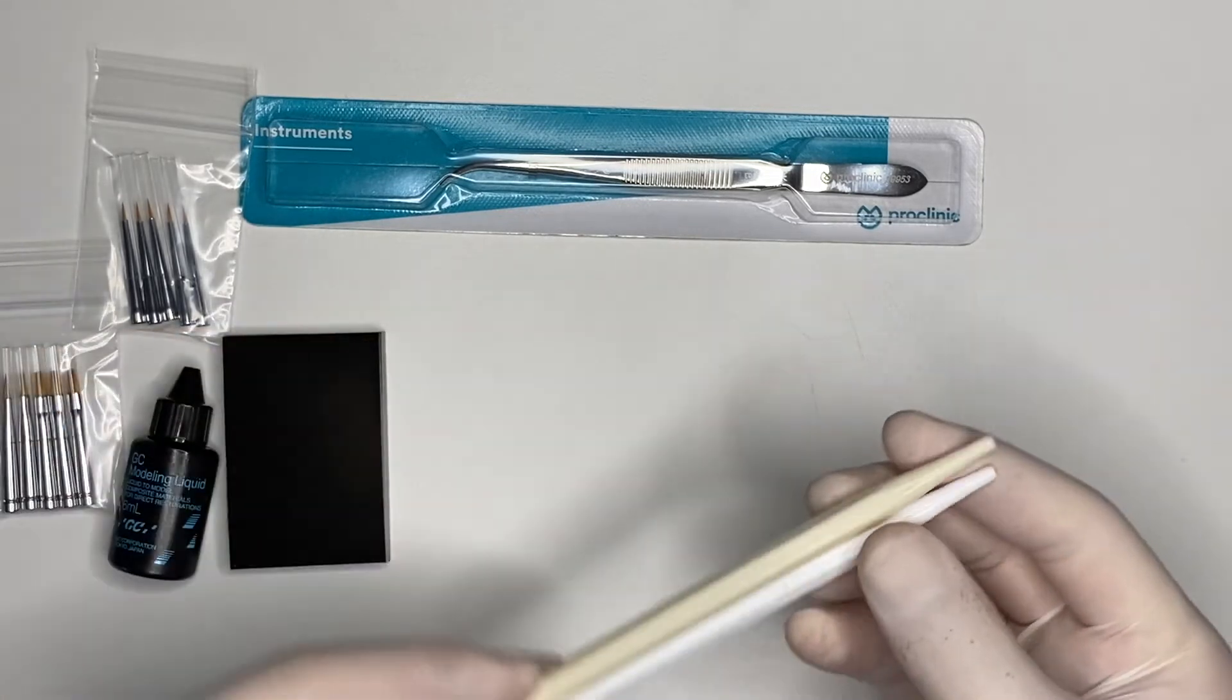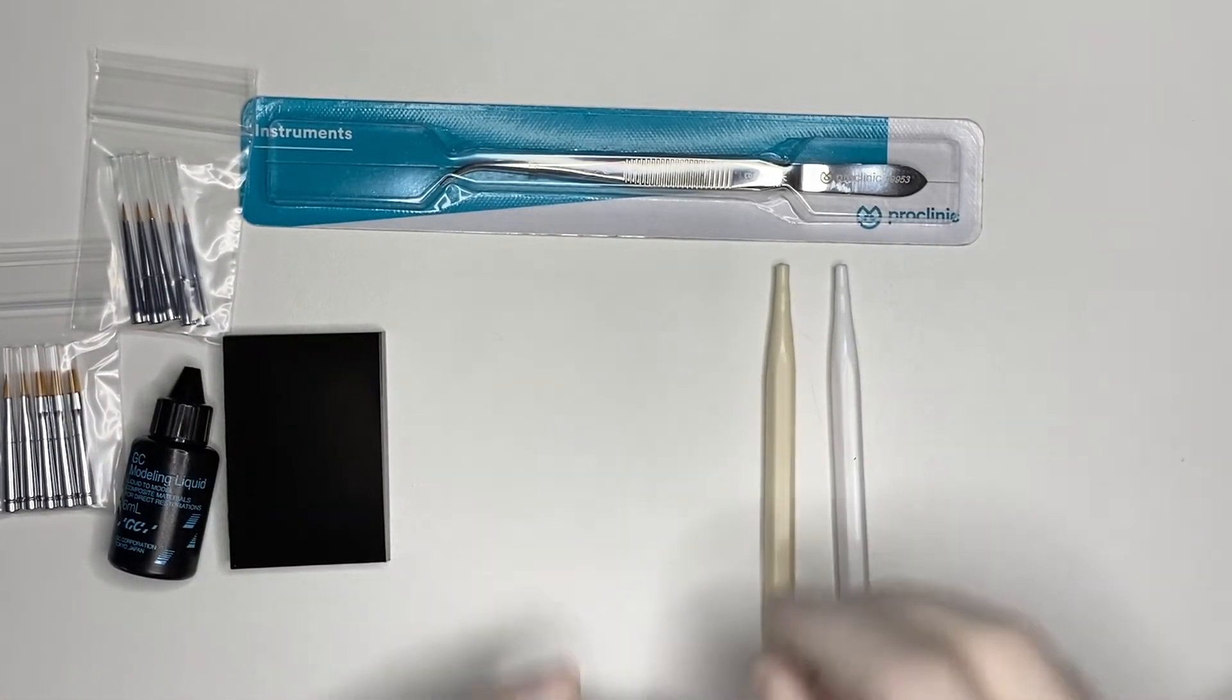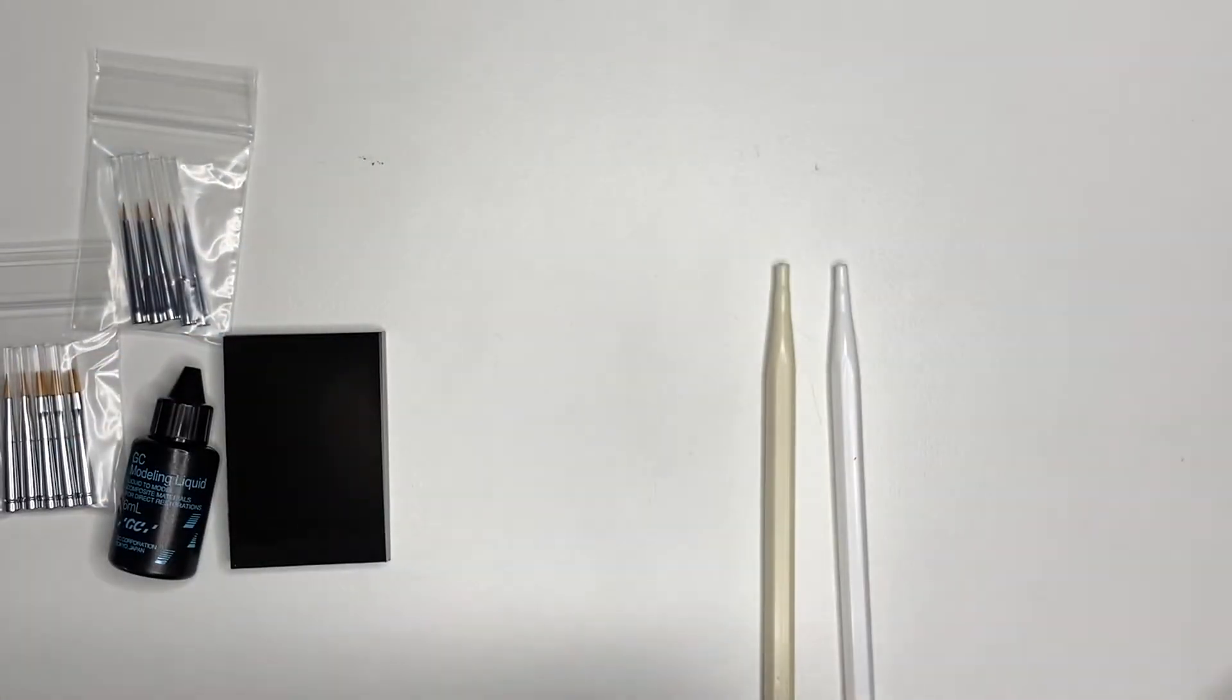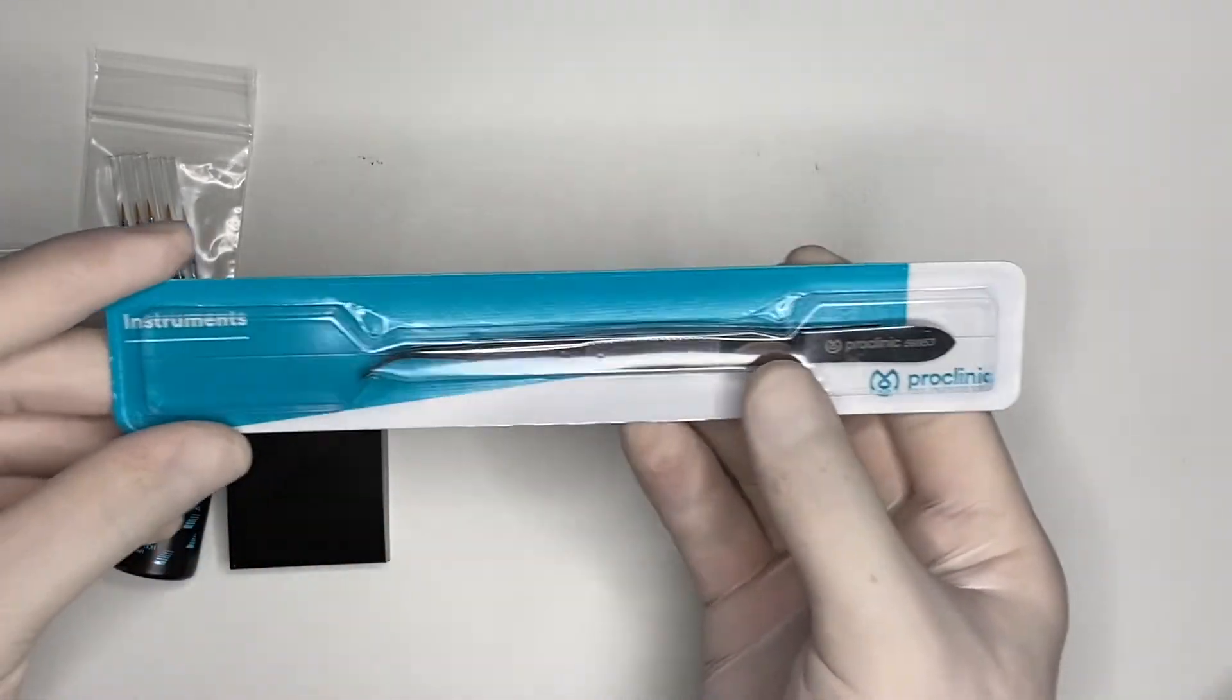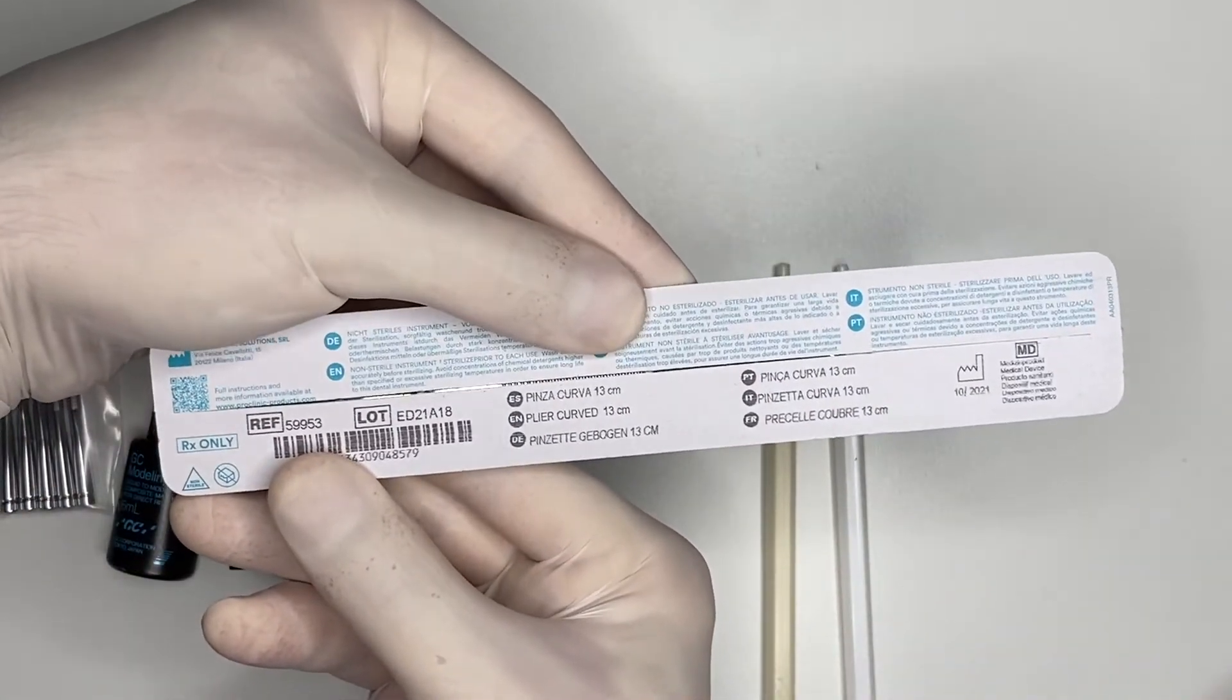And also two handles for your brushes. But what's really nice about these is what you can actually do with them. As you see, I've already prepared my pincer here. It's a Pro Clinic Standard 13-centimeter curved plier.